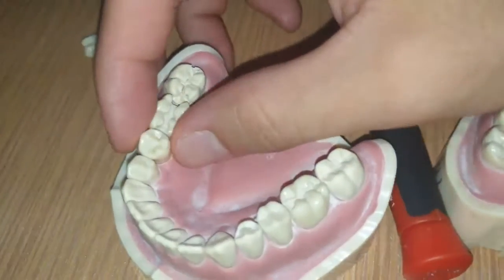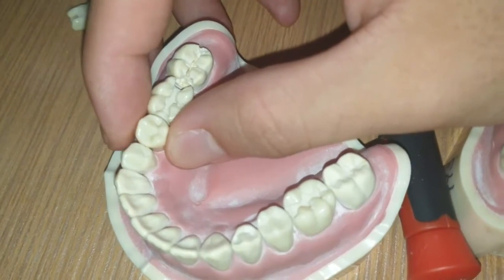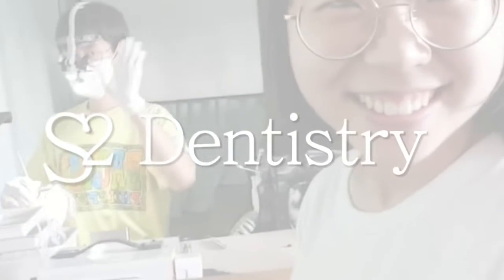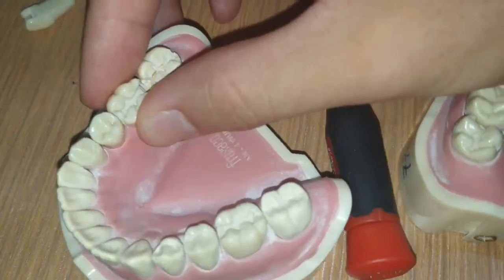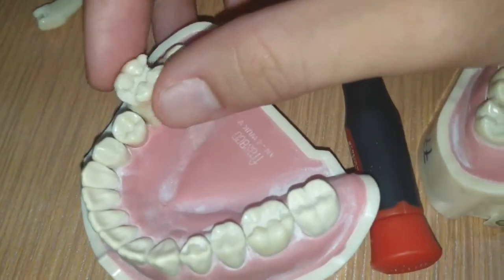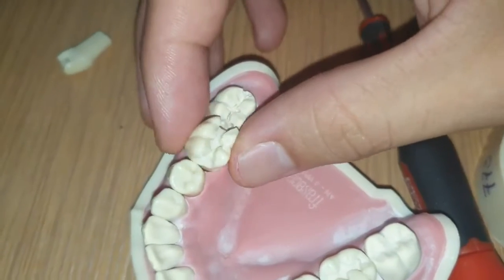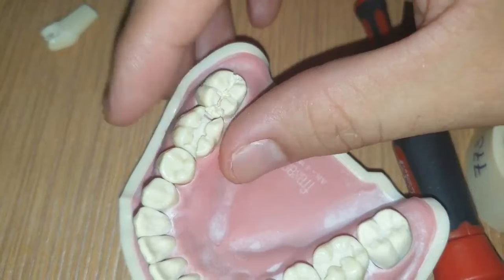Today, I'm going to carve tooth number 29, the second premolar, in the mandible. But the thing is that the adjacent tooth is my last molar, and I made an MOD on that tooth.